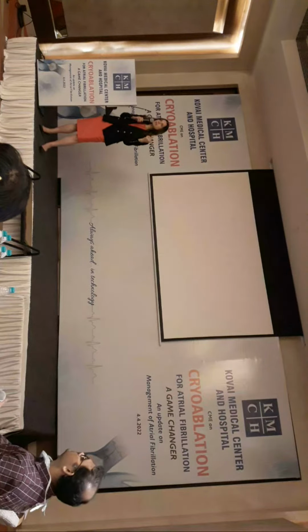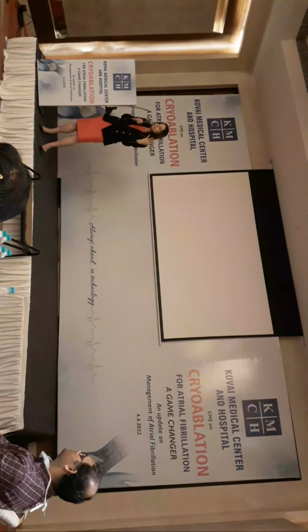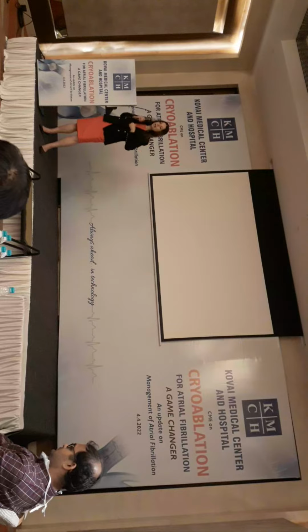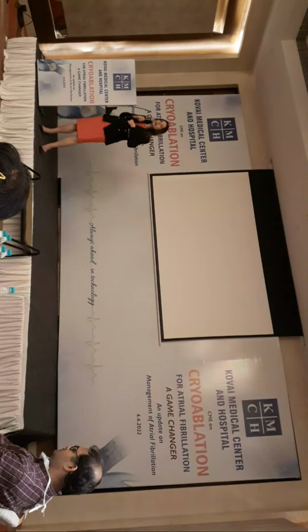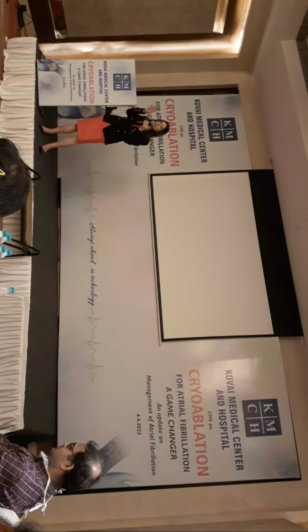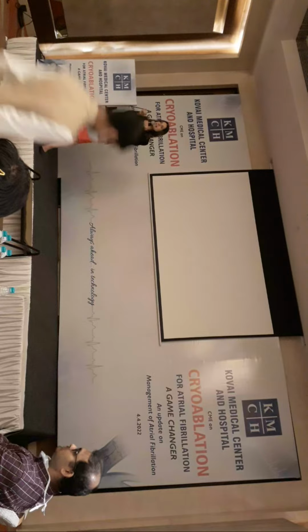We also adopted, maybe 6 or 8 years ago, something called compound motor action potential. We call it CMAP. When the staff are prepping the patient, they put a little electrode near the right-sided diaphragm, away from the mapping patches, and we're able to see an action potential on our screen below the EP potentials for the pulmonary vein. That is the diaphragm when it's being stimulated.